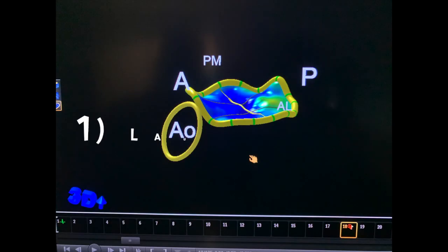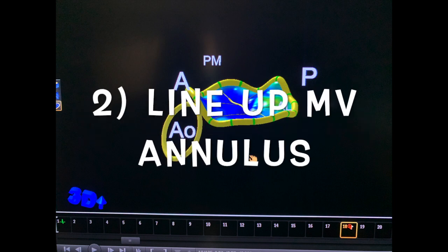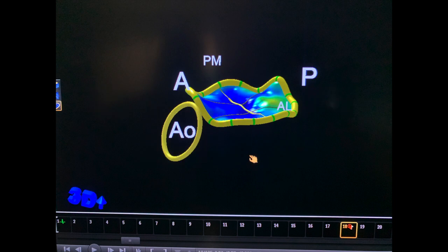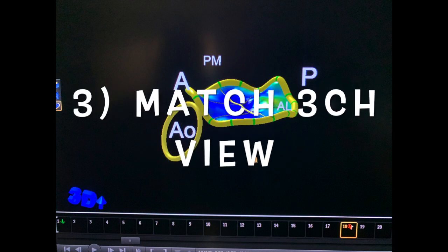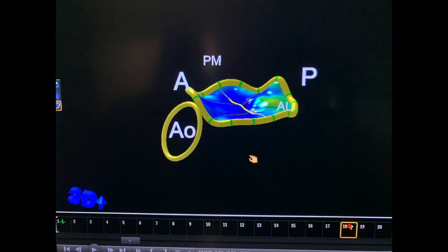Now as a summary: number one, launch MVQ. Number two, line up the mitral valve annulus with the horizontal purple line. Number three, match the right upper quadrant box with the equivalent three-chamber view by rotating the short axis box, which is the left lower quadrant box on MVQ.